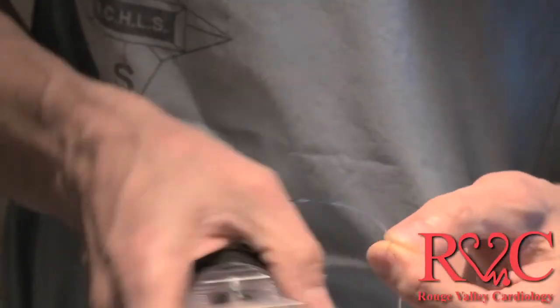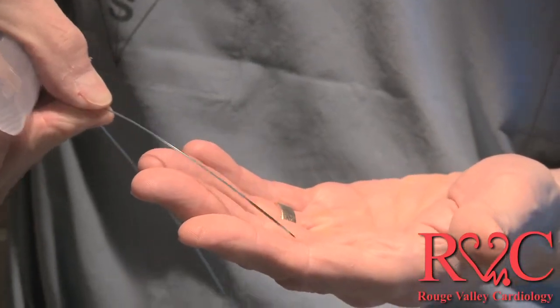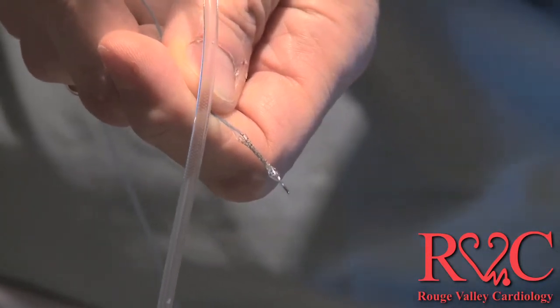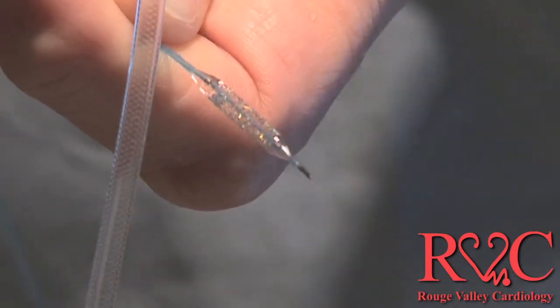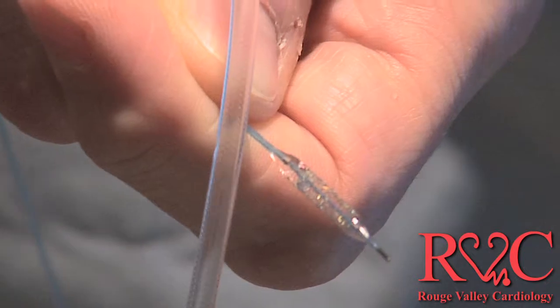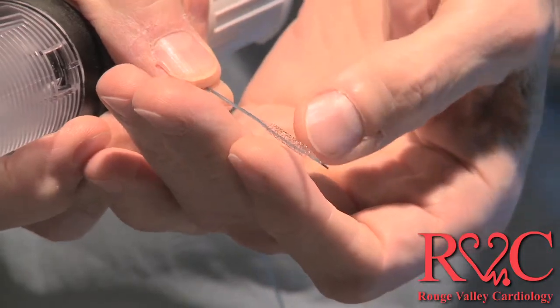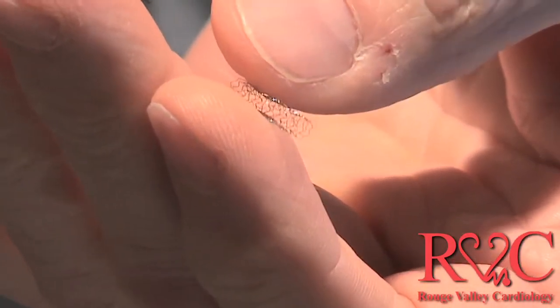I have an example here of a catheter that has the balloon on it, and what we would use is a device such as this to inflate the balloon. Typically pressures of anywhere between 4 and 20 atmospheres of pressure are used to open this balloon up. Now what we'll do is we'll have a look carefully at this balloon here that has the stent on it, and then you can see the balloon inflate and deploy it.